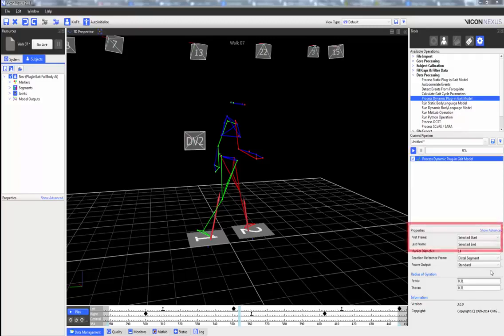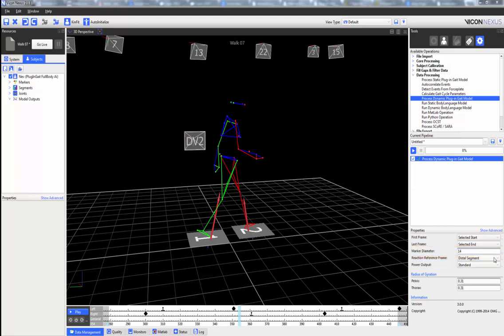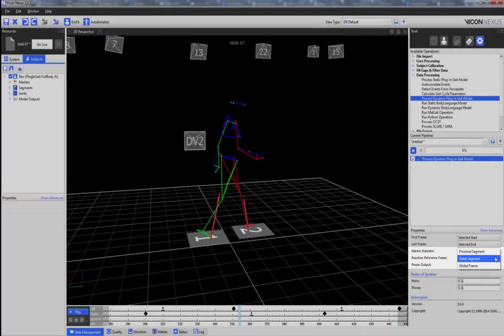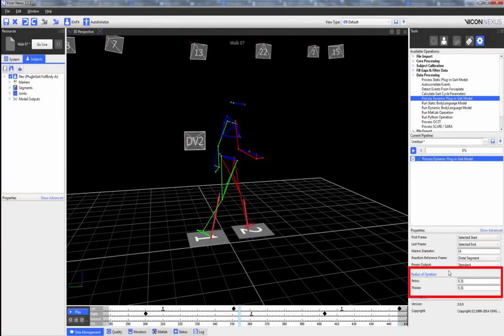The properties we can adjust are the first and last frame, the marker diameter in millimeters, whether the reaction reference frame applies to the proximal segment, the distal segment, or the global frame, and we can also adjust the radius of gyration of the pelvis and the thorax.